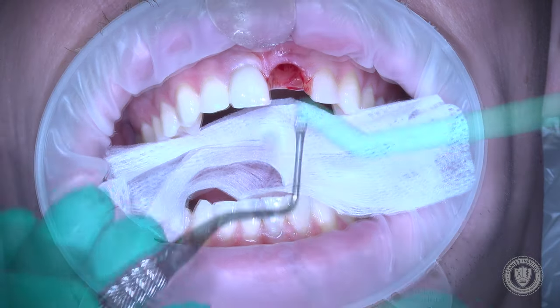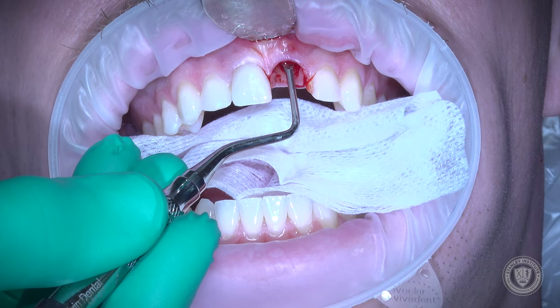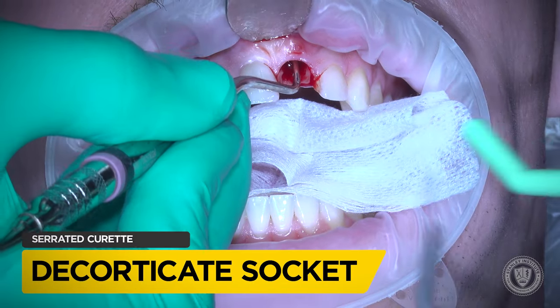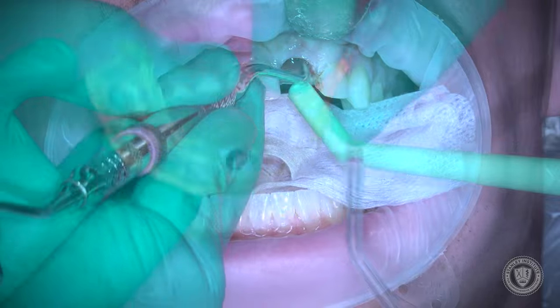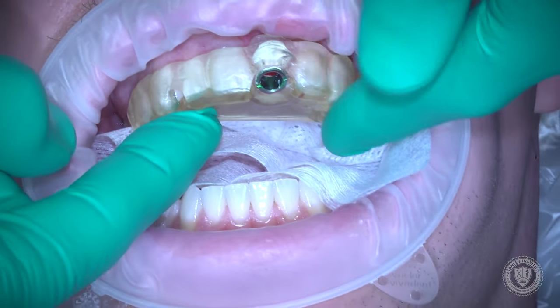Right after you do this extraction, you have to assess whether that buccal plate is intact. I'm using a curette to feel where that margin is. The crest of the bone is two to three millimeters below the free gingival margin, and so that's perfect.